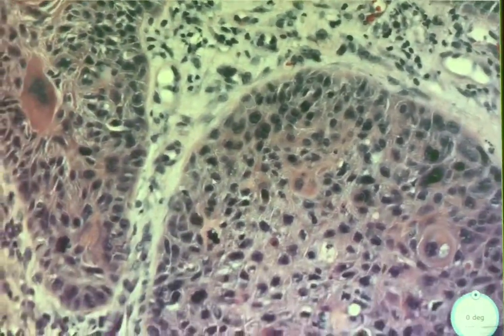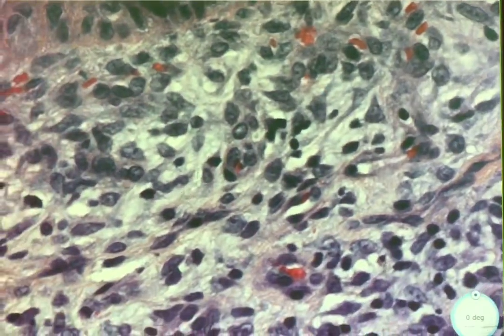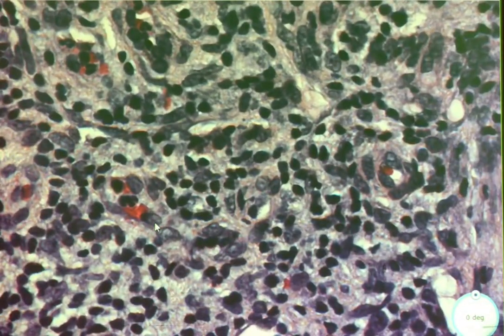Those are red cells, but there's probably going to be an EO somewhere. But really, it's not so much the dermal process, it's the ingrowth. Those are red cells. There's an EO, but it looks like it's in a capillary. So this is invasive squamous cell carcinoma, or just squamous cell carcinoma. Maybe an EO here. It's in a capillary.